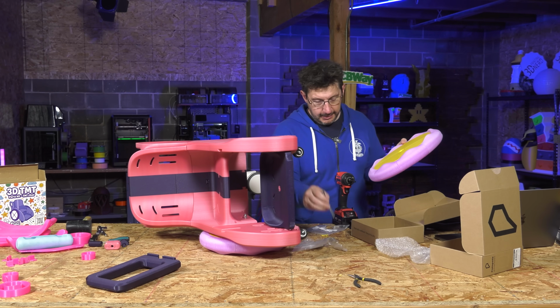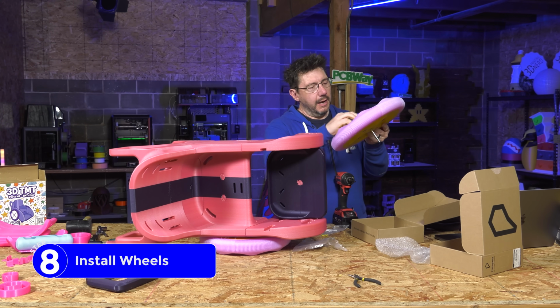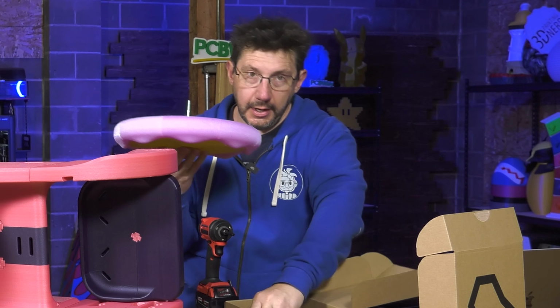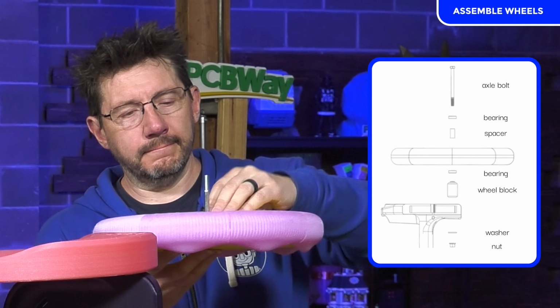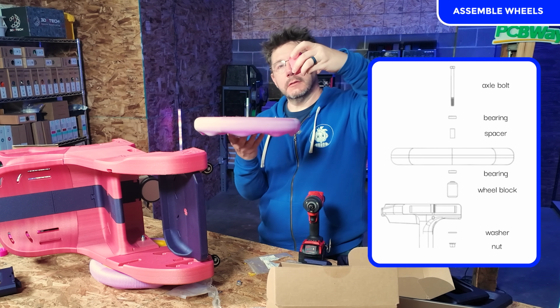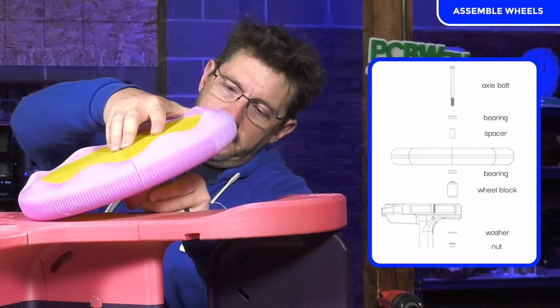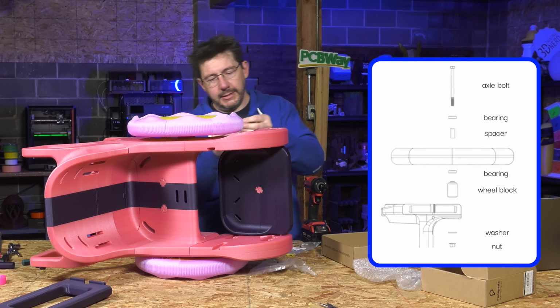It goes bearing on the bolt, and that goes through. You put a spacer over that, and then you put a bearing over that. And then that goes in the wheel block, which is here. And then that goes in here. And then we have a washer and we have a nut to go on the other side.